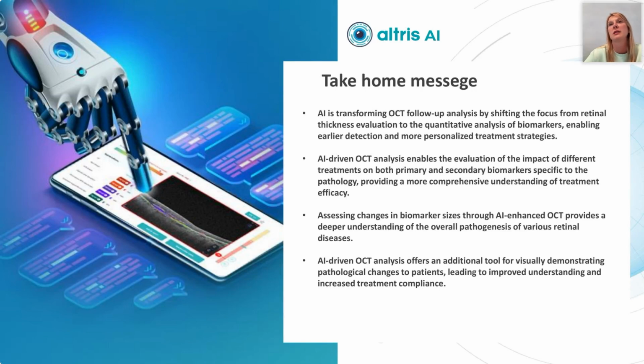We can understand when and how we need to change treatment strategies for our patients. And also AI-driven OCT analysis offers an additional tool for visually demonstrating all those changes to our patients, which can dramatically increase their compliance to the treatment.